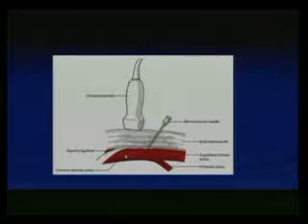And you have to be very careful. So if the needle is very close by here, then sometimes it's a very acute angle. It's difficult to pass the wires and the sheath. So you have to make sure you're a little bit away from it. And sometimes I've seen that the problem is you have the ultrasound here, you're getting the needle, and you're not able to see the needle tip. And the needle tip is past your beam, past your probe. So you have to make sure that it transects easily.